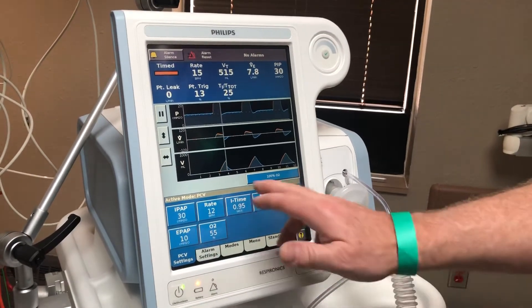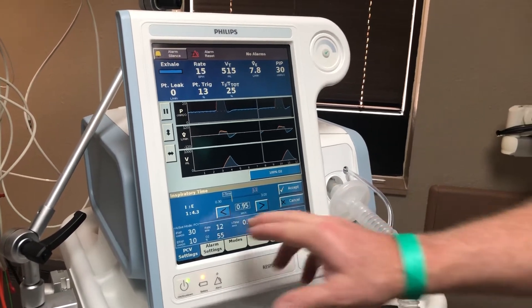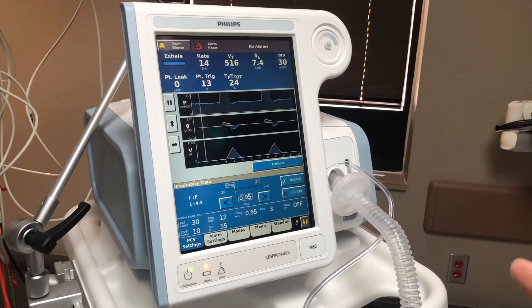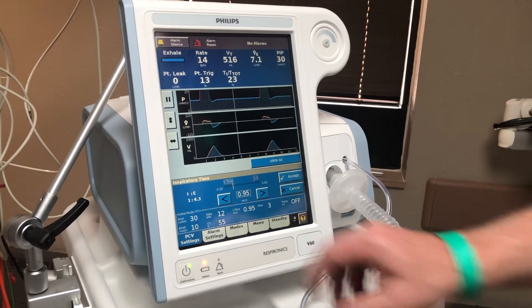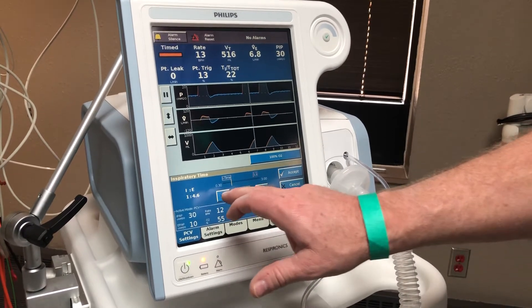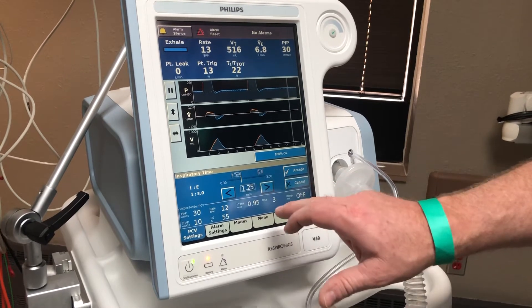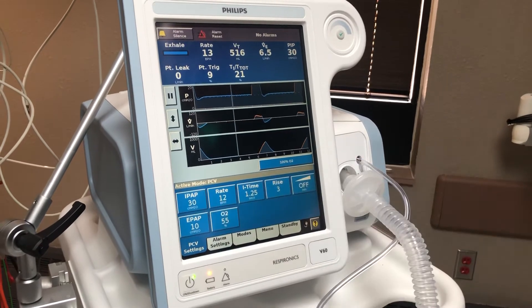In the same way, for your inspiratory time, right now we have it at 0.95. At 0.95, if you highlight it, you can tell it's at a 1-to-4 ratio because we're on a respiratory rate of 12. We kind of like at least a 1-to-3 ratio, depending on the patient. So if you turn it up, we'll find a 1-to-3 ratio — at 1.25 that's a 1-to-3 ratio. We'll accept that.